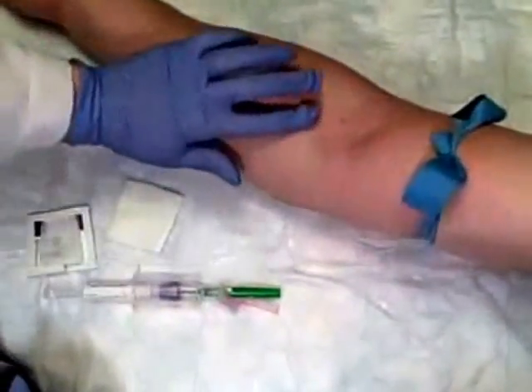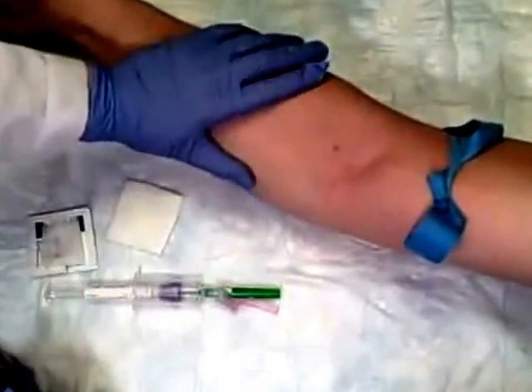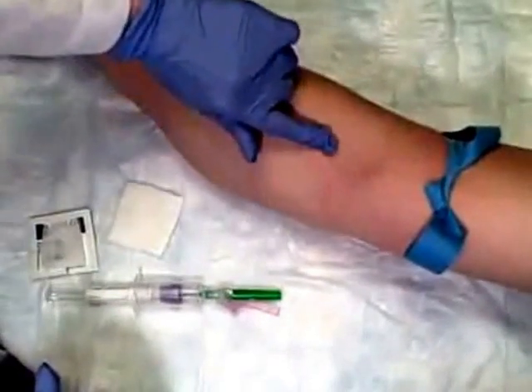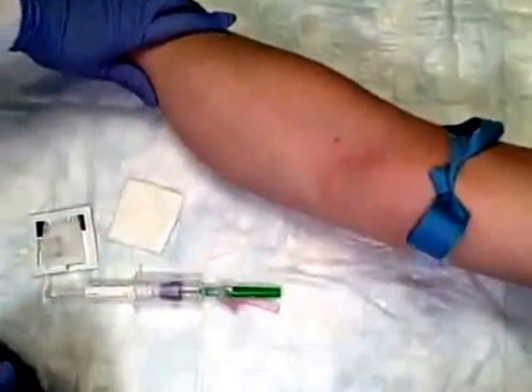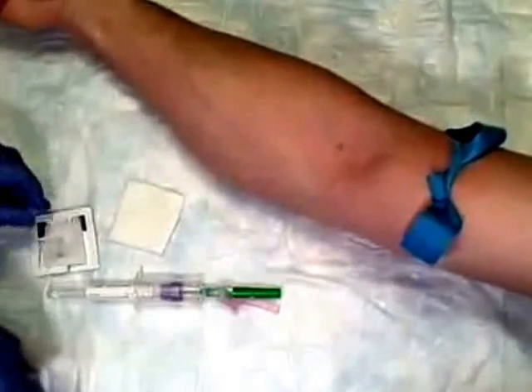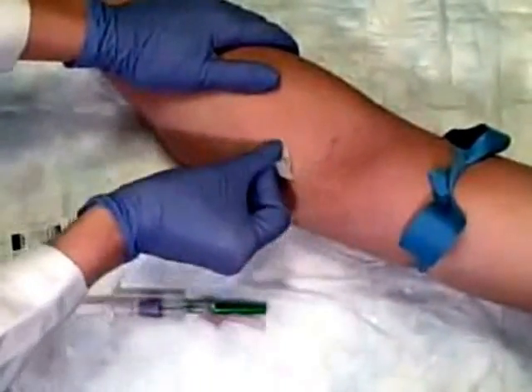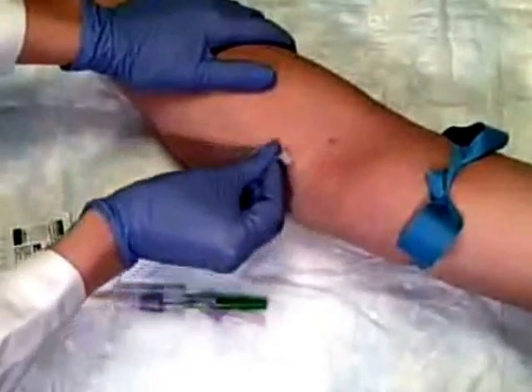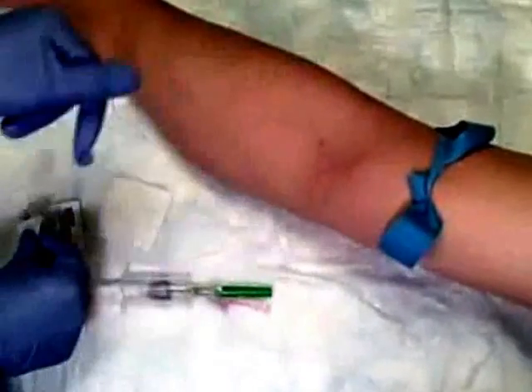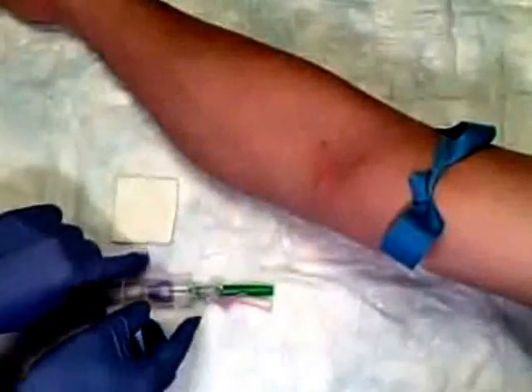I'm going to have my patient make a fist so I can see which veins are going to be good. It's very important to palpate. I think we're going to try this one right here. I'm going to cleanse the area — you can see I'm cleansing in a circular fashion. We'll let that dry, as the alcohol can sting a little if you poke the patient while it's still wet.